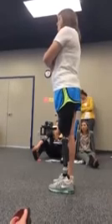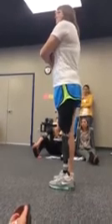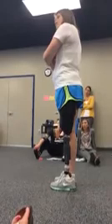One of the other things that works on carpet sometimes is an auditory effect. So either where you can hear the footfalls, where it's like clunk, clunk, clunk, clunk. It shouldn't sound like a heartbeat. Walking should sound like a metronome. Clunk, clunk, clunk, clunk. Right? So sometimes if all else fails, I try to get patients to tune into the auditory part.